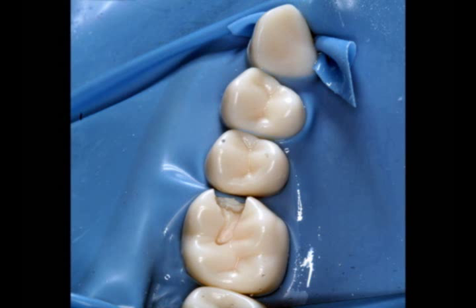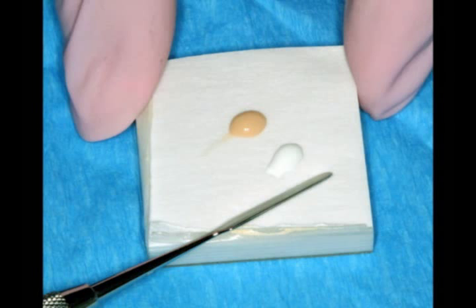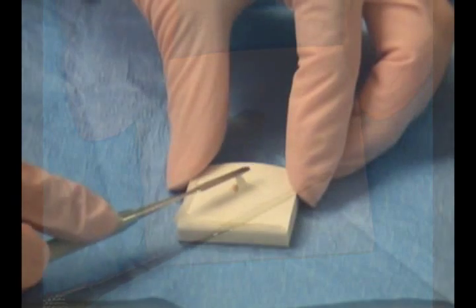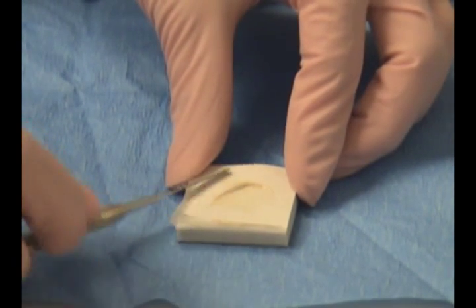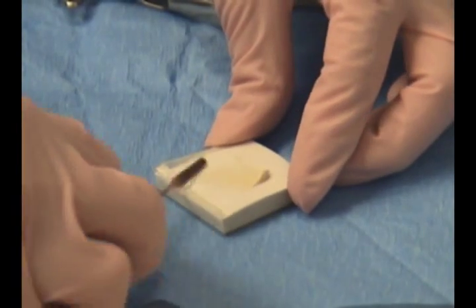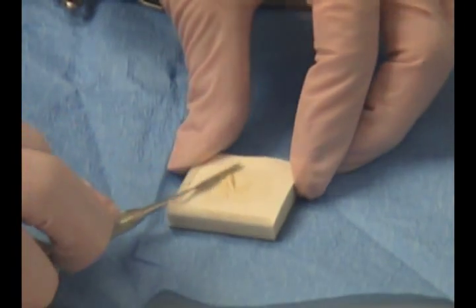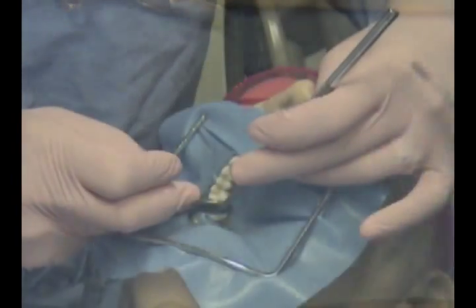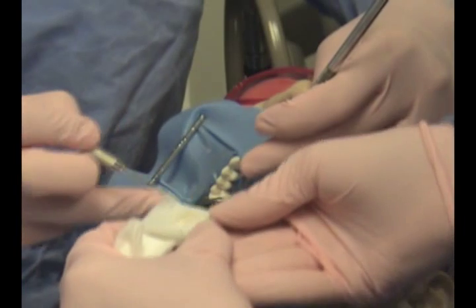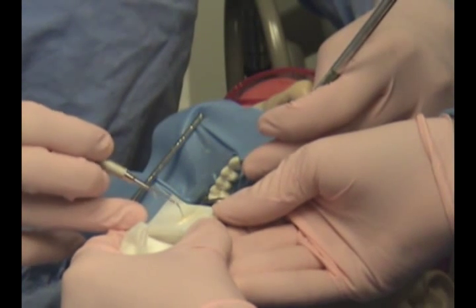The restorative procedure will now continue by placing Dycal and Copalite into the preparation. A small amount of Dycal is placed on a mixing pad. Using the entire surface of the mixing pad, the Dycal will be thoroughly mixed. A small amount of Dycal is now placed on the end of the Dycal mixing instrument, and the instrument is now transferred to the operator for placement.